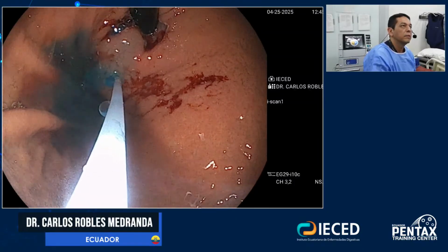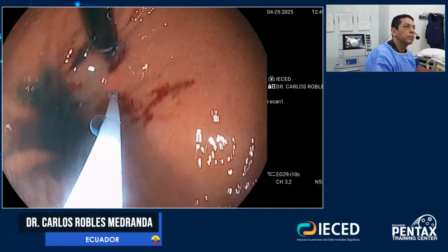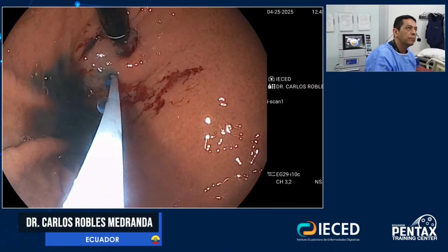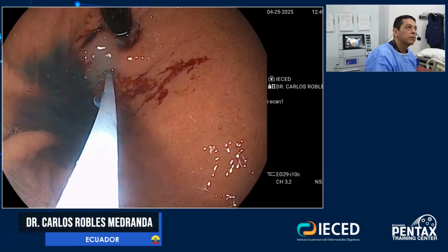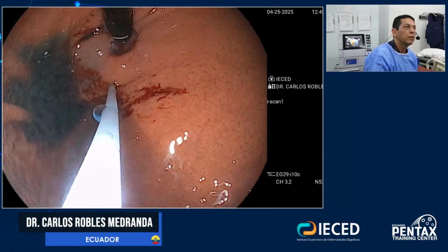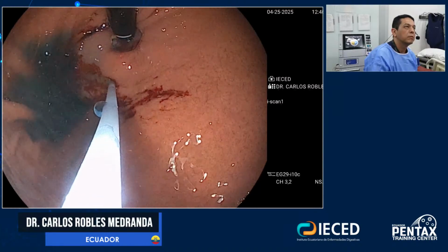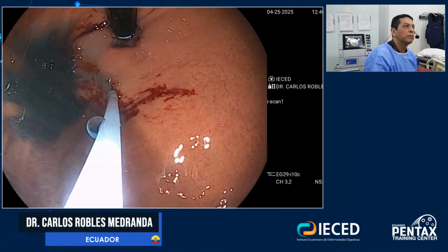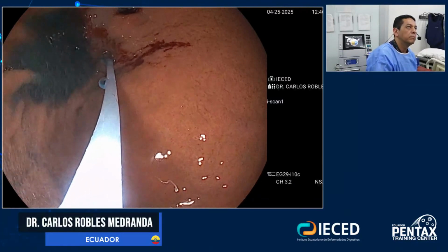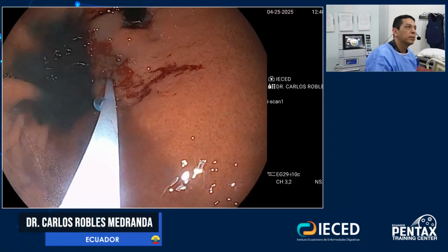Inyecta. Para, retira. Abre. Inyecta. Para, retira. Abre. Inyecta. Para, retira. Un momento. Abre. Inyecta. Sigue. Para, retira.